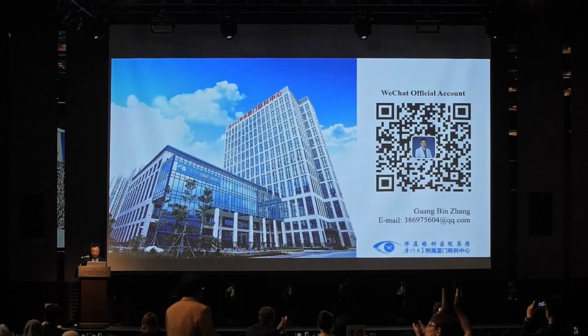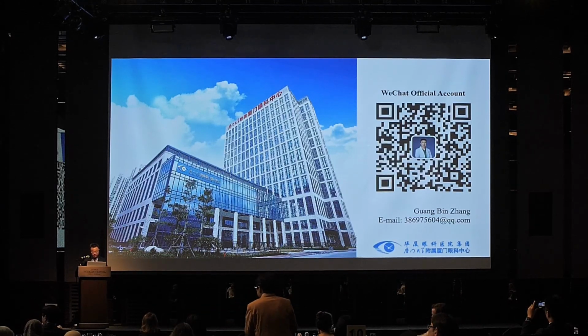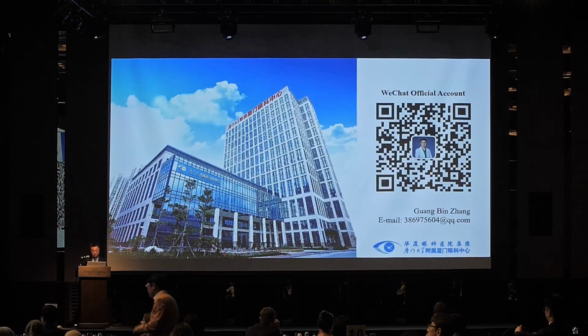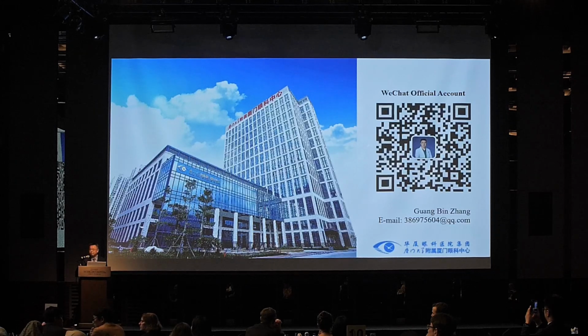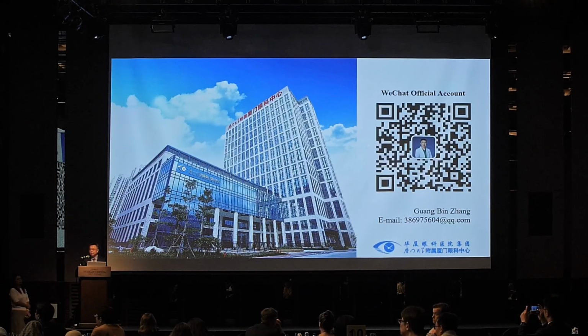Thank you. Any questions? I have a question for you. I realize if you're using IOLMaster and Callisto, you transfer the data from IOLMaster to Callisto, and therefore remove the requirement to manually mark the eye.